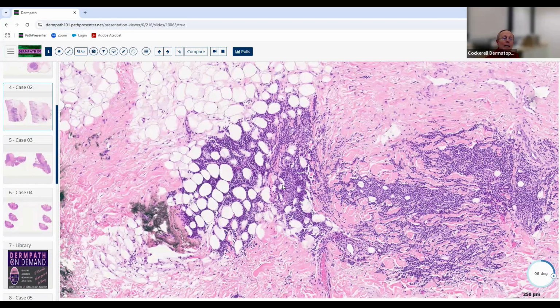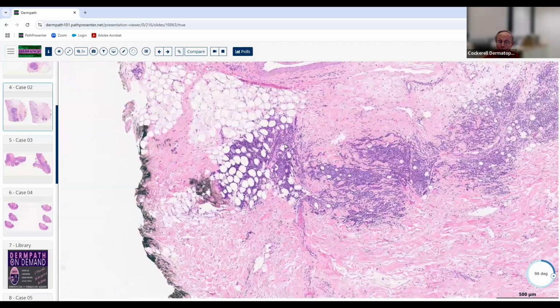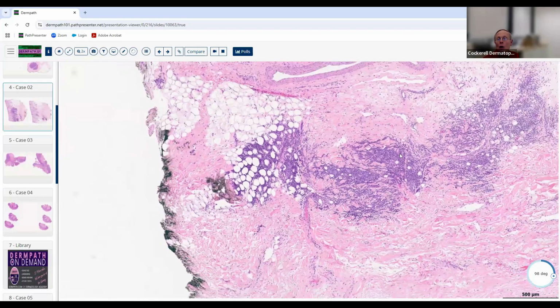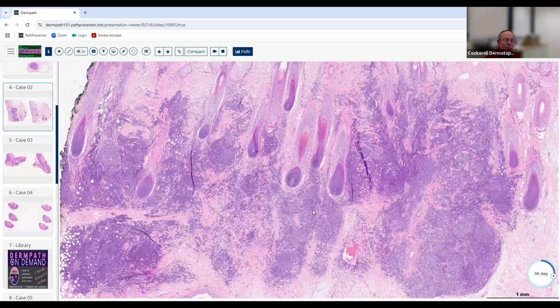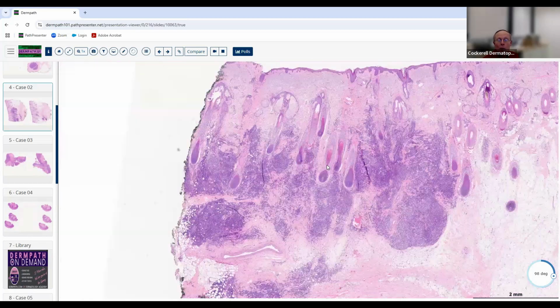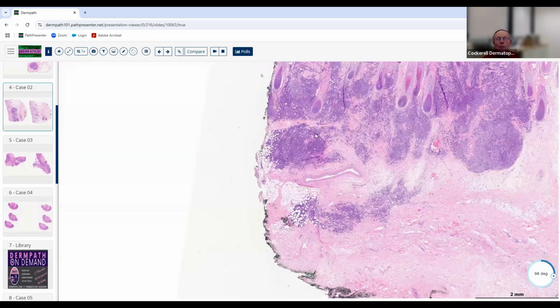Panniculitis-like T-cell lymphoma, those gamma delta T-cell lymphomas, tend to involve the subcutaneous fat, and they give you a pseudopanniculitis. I know a lot of guys love lymphoma pathology, and my hat's off to them. That's great. But I hate lymphomas because they don't read any textbook. You almost have to do special stains and flow cytometry and all this kind of stuff, because you'll see something like this, and then lo and behold, there's a B-cell, there's a T-cell pattern. It's involving the panniculus. That's uncommon for cutaneous B-cell lymphoma.